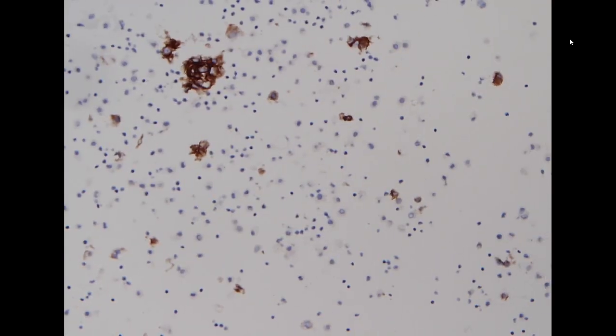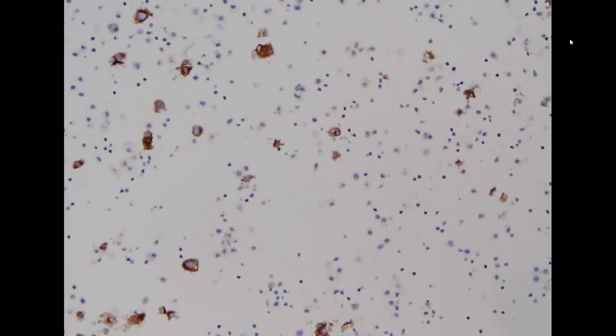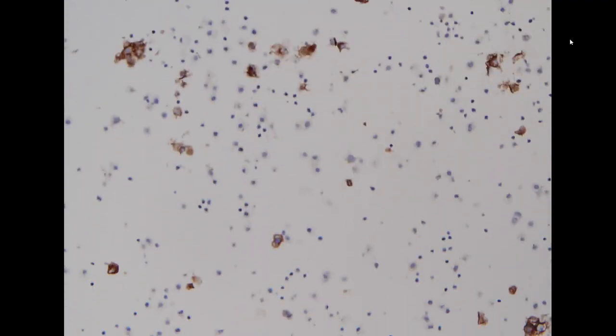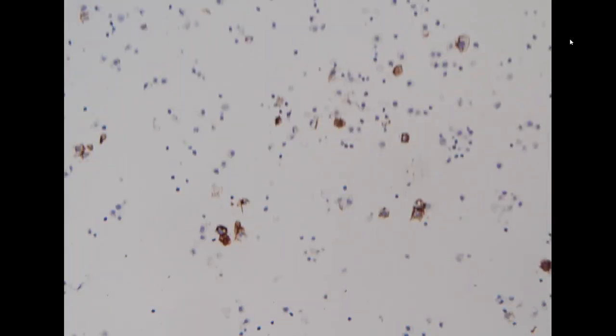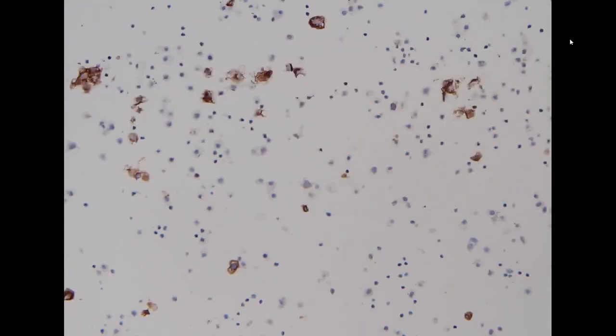So you see, the individual cells as well as small cell clusters were strongly positive for MOC31. So I think we can call these metastatic adenocarcinoma. And then we check the prior specimen from our hospital. He does have one specimen that we sent out as negative.